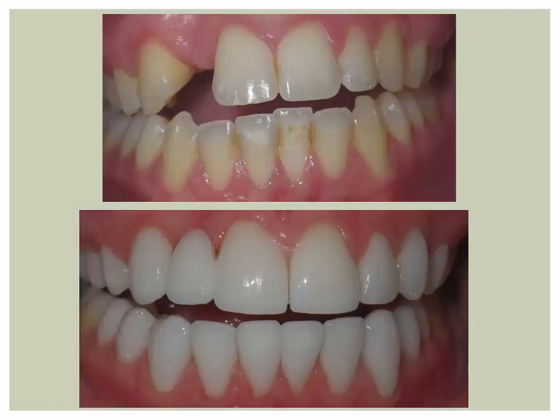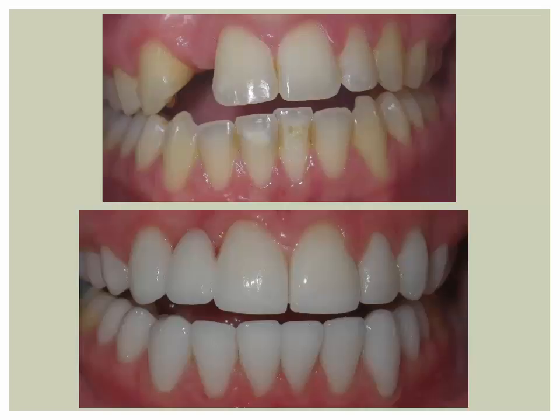She did try to bleach her teeth beforehand. It is unusual for me to put veneers and crowns on an 18-year-old, or probably 17 actually, in her case. The nerves are very large in the teeth, and you have to be very careful not to irritate the nerves in her teeth. So we usually wait to a later stage. But the bleaching obviously didn't help. She had some splotches on her teeth and indentations that picked up stain. Her teeth were yellow and they weren't bleaching. So to have a nice pretty senior picture, there wasn't much choice but to accomplish what we did in the bottom picture.